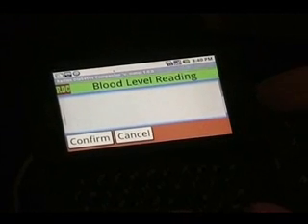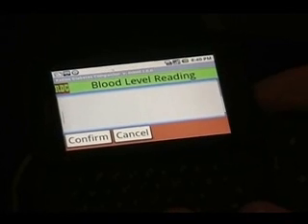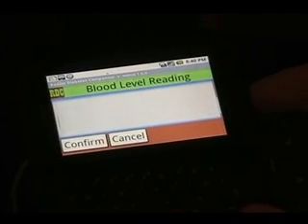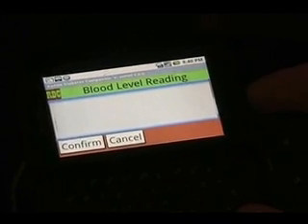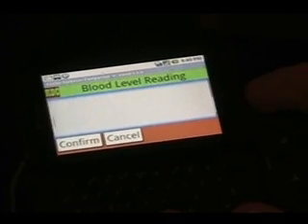Like the other day, I came home from work, and this is U.S. readings, I was at like 70, which is low for me. I wanted to put something in the comments because, while it's not officially below, for me 70 is pretty low.